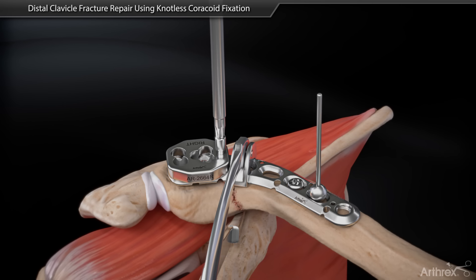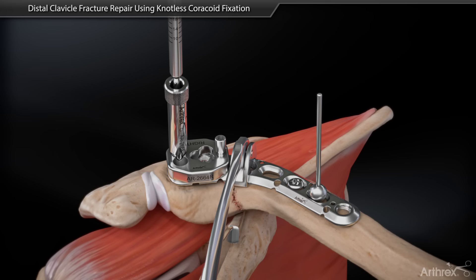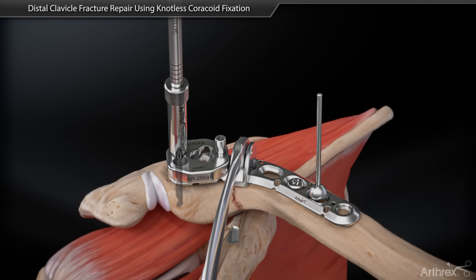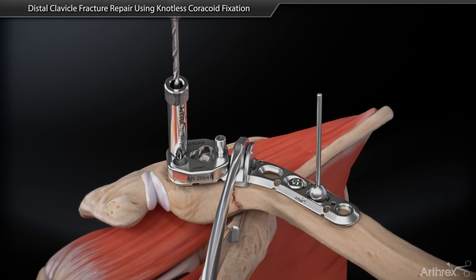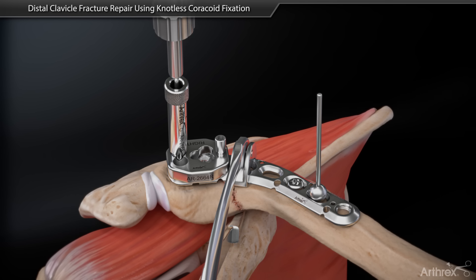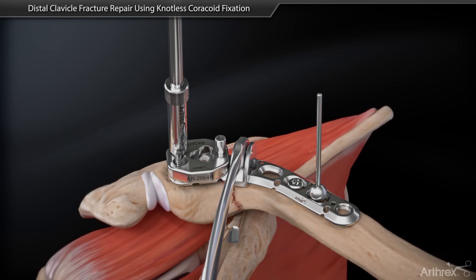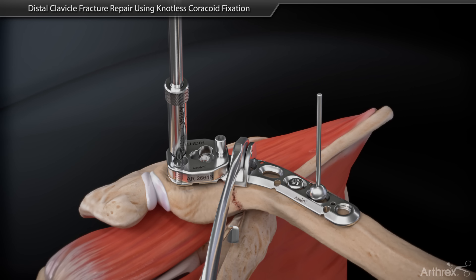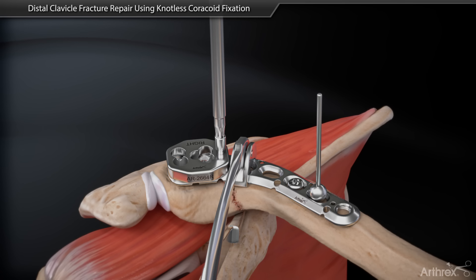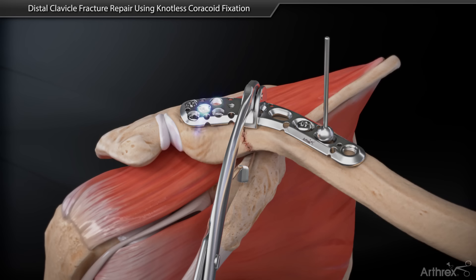Use the distal drill guide into the plate and insert a guide sleeve. Leave the guide sleeve in place and drill a bicortical hole. Measure for screw length and insert the screw through the guide sleeve until it seats flush into the plate. Repeat for the other desired screws.